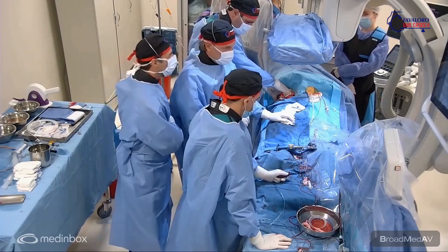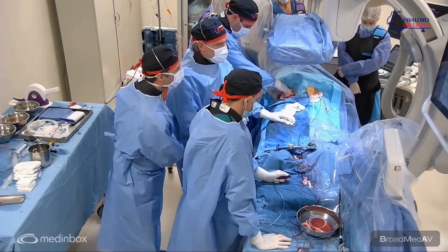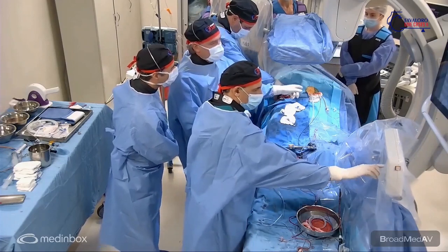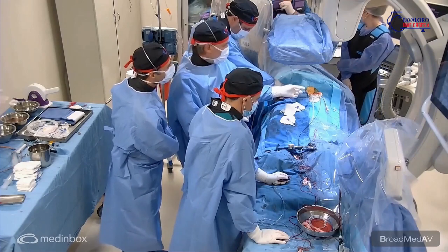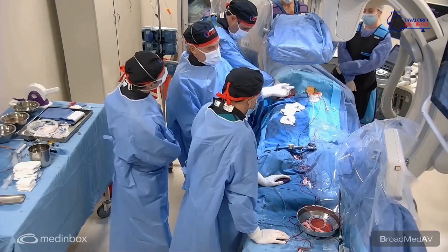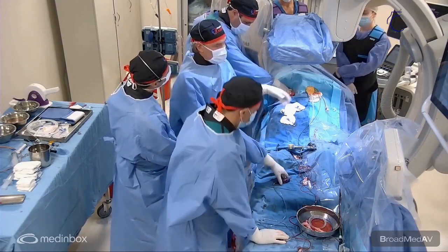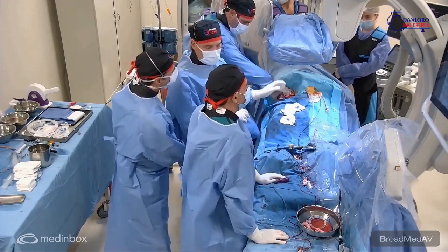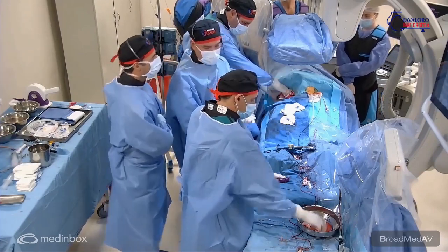Now, what kind of covered stent would you use? For such a patient, it is very easy to put a balloon expandable stent, because for a self-expandable stent, we have to use the 9 French contralateral sheath. So with this 7 French, we can cross over. We can put a crossover sheath, and over this 018 wire or the 035 wire, whatever wire, we can deploy the covered balloon stent. We can do the test with the sheath, and for sure it's going to be okay.